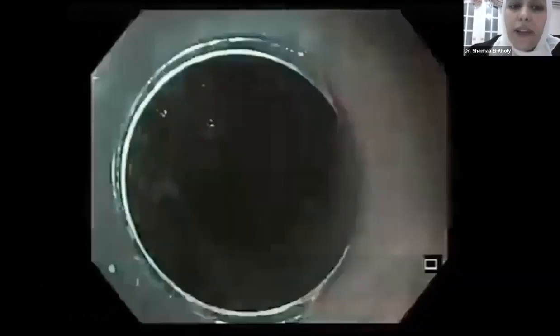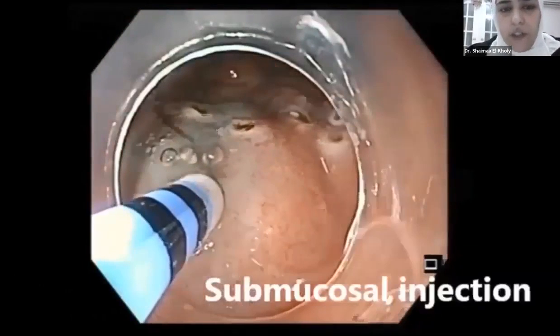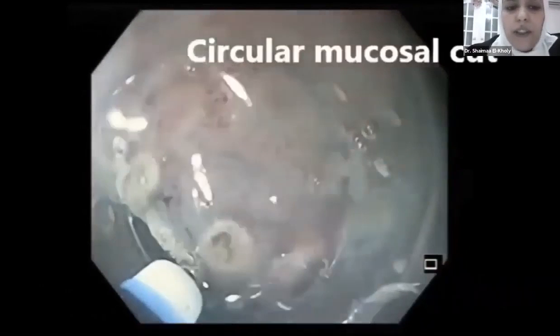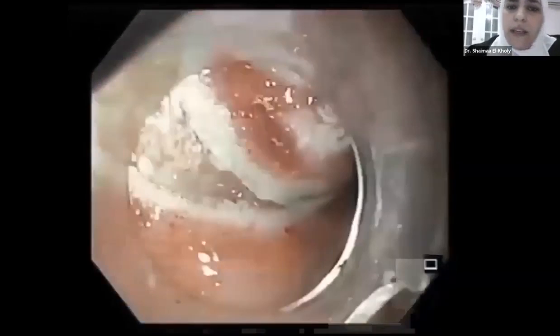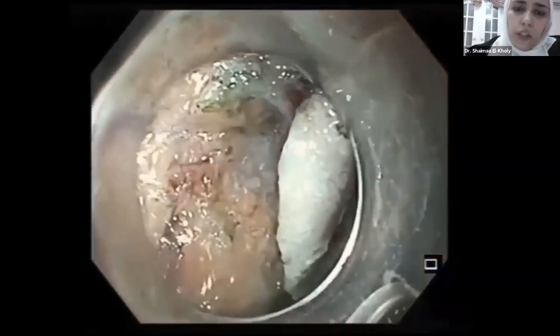And then after the marking, we will go with the circular incision. As you can see, first injection, of course, and then the circular incision. It's a very nice demo because you just cut outside the marking so that you get a very good safety margin. And you can see here, after the circular incision, we start to go beneath the lesion.